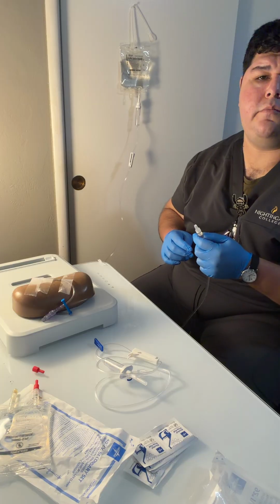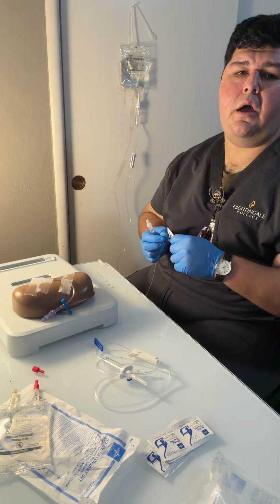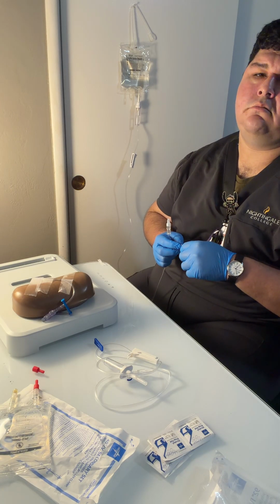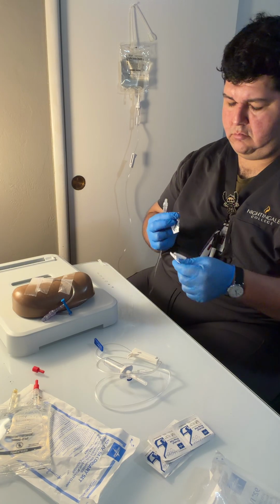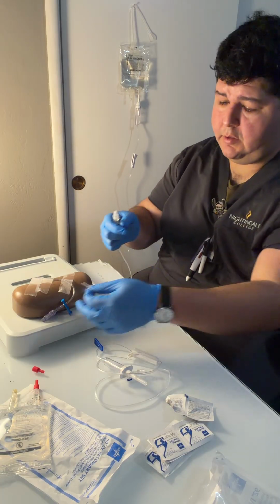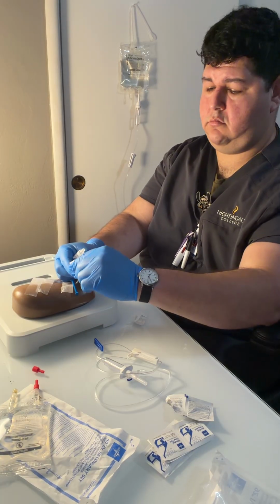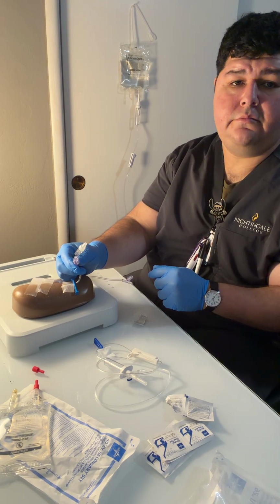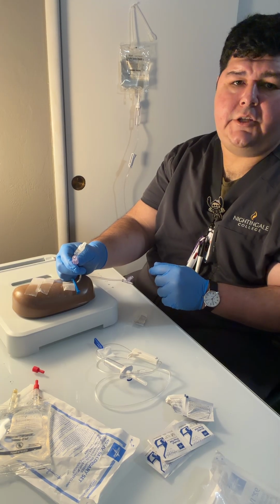Okay, then we're going to close it. Next, we're going to use our alcohol prep pad. We're going to clean our patient's IV site and the saline lock. We're then going to give it a minute to dry. And then we're going to go ahead and attach our primary tubing.